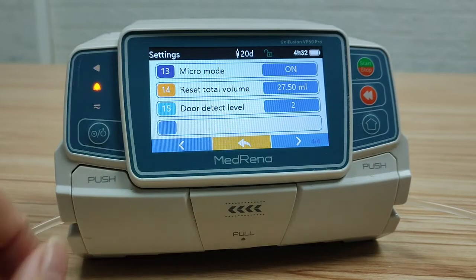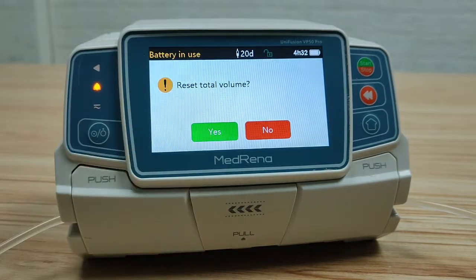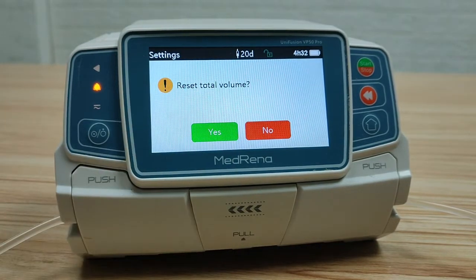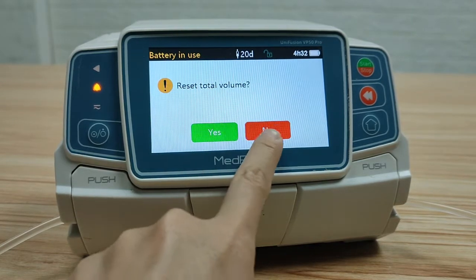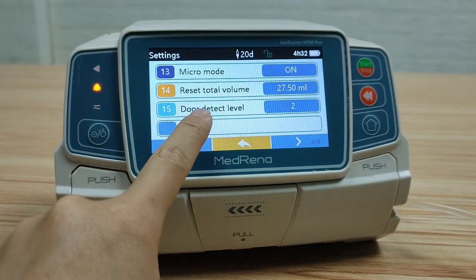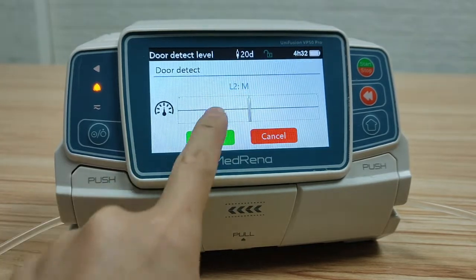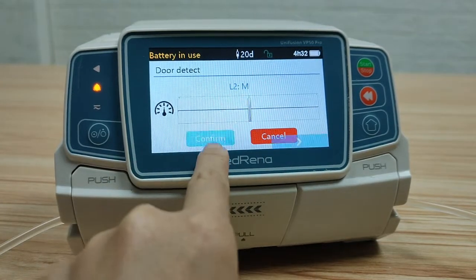Reset total volume: if selecting yes, the data of infused volume will be cleared. Door detect level: there are three levels for choosing.